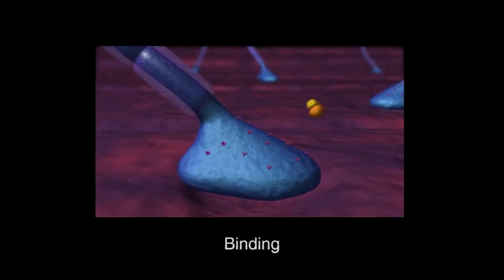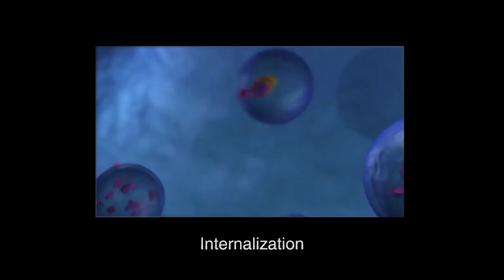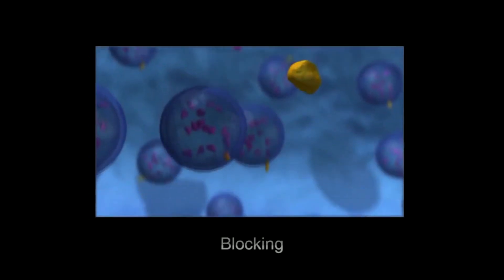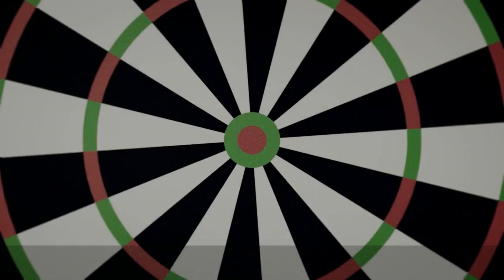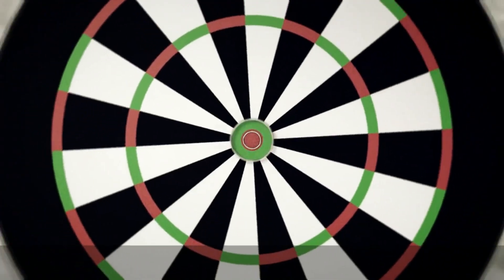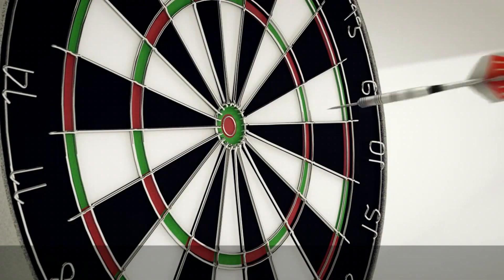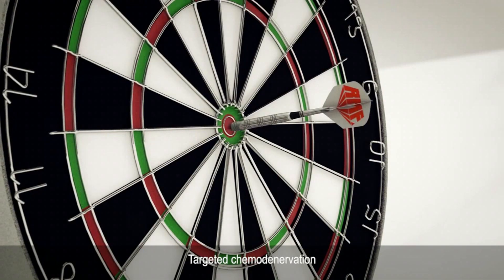Botulinum toxin acts by blocking the release of acetylcholine at the neuromuscular junction. In this video, we demonstrate the technique of targeted chemodenervation for hemifacial spasms.